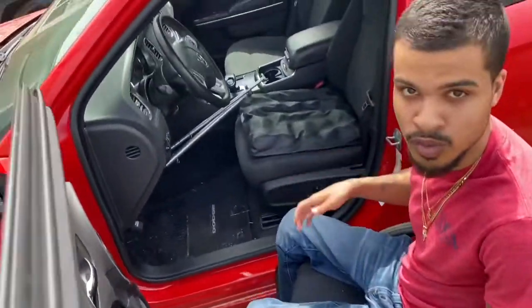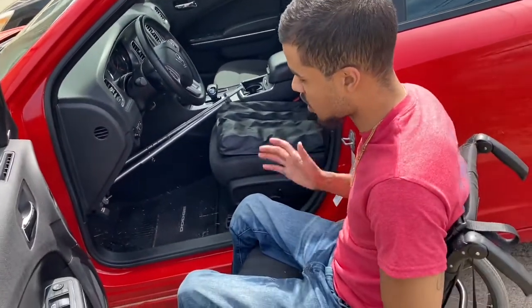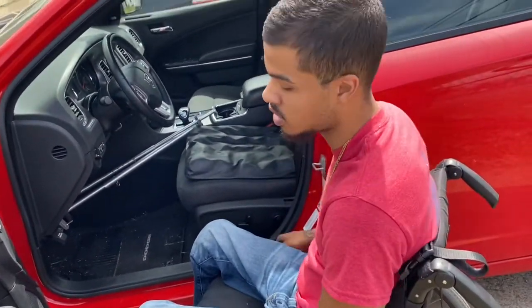I kind of pull up at an angle when I do it, because if you don't, you've got to come all the way over the wheel and that makes it a lot harder trying to get yourself all the way up over the wheel. So kind of come in at an angle whenever you go to get in the car.